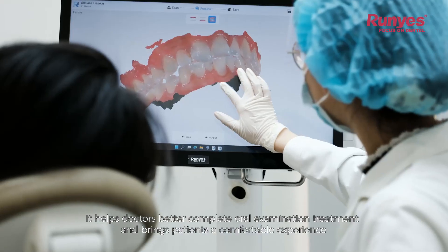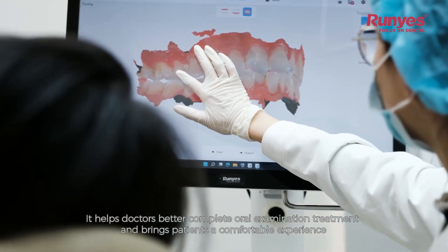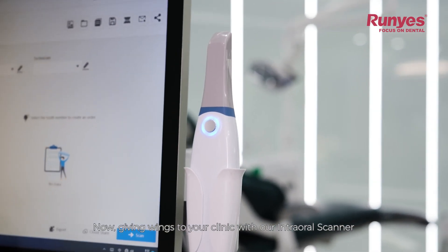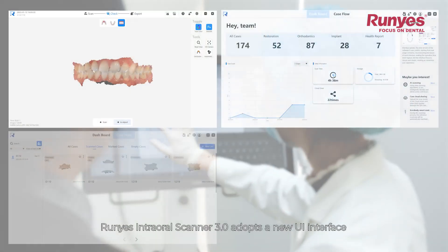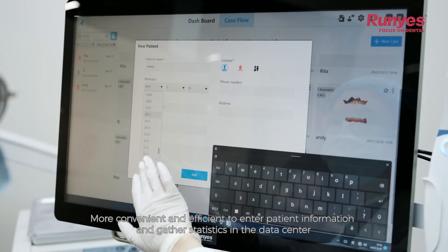It helps doctors better complete oral examination and treatment, and brings patients a comfortable experience. Now giving wings to your clinic — Runyes Intraoral Scanner 3.0 adopts a new UI interface, more convenient and efficient to enter patient information and gather statistics in the data center.